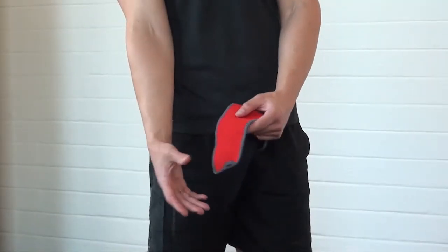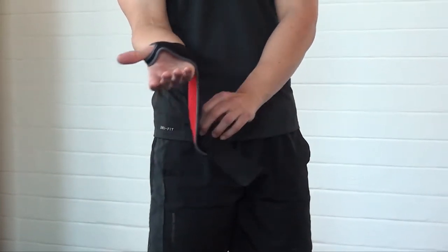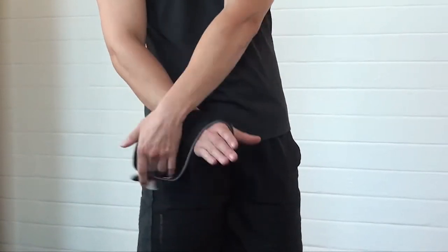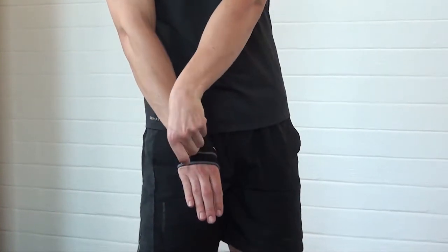The first step would be to slide the thumb into the opening provided. This brace has the added advantage of being able to use on the palmer surface of the wrist or over the dorsum of the wrist. Apply or fasten the velcro strapping to provide the necessary compression.